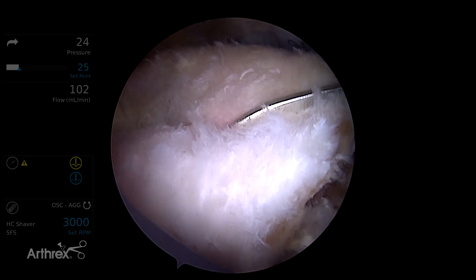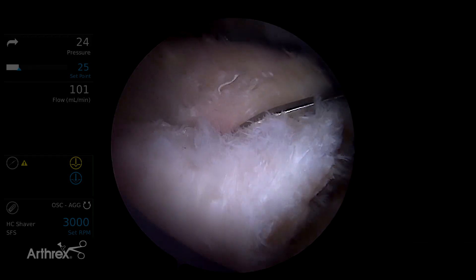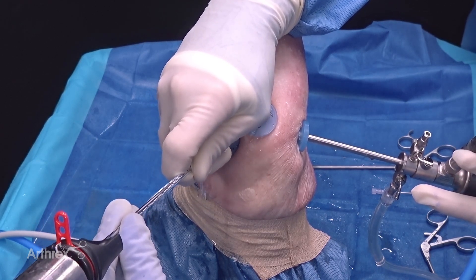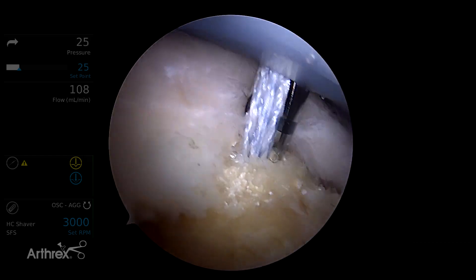So here we have a right shoulder with a large rotator cuff tear. In my mind this is a tear that's amenable to a three-anchor medial row repair. I like the FiberTek RC anchor because this allows us to place three anchors with minimal violation of the footprint. We can maximize footprint contact area without violating the bone as much as compared to hard body anchors.